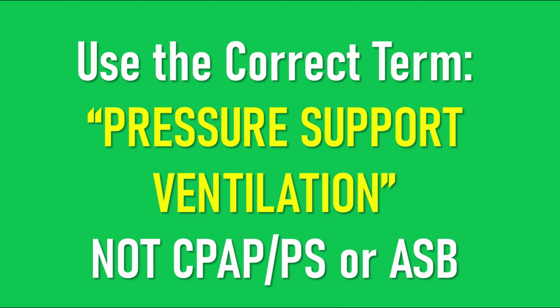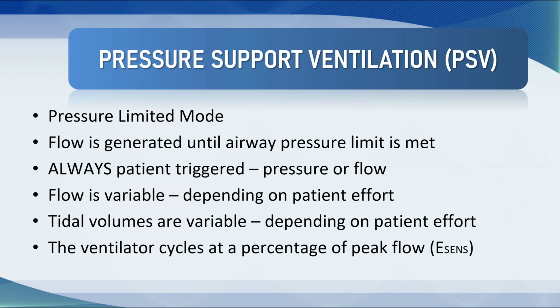And please don't use proprietary terms such as assisted spontaneous breathing. This is known as pressure support ventilation, and that is the only term I'm going to use with reference to the specific mode that is pressure support in these tutorials. So it's a pressure limited mode. Flow is generated until the airway pressure limit is met.